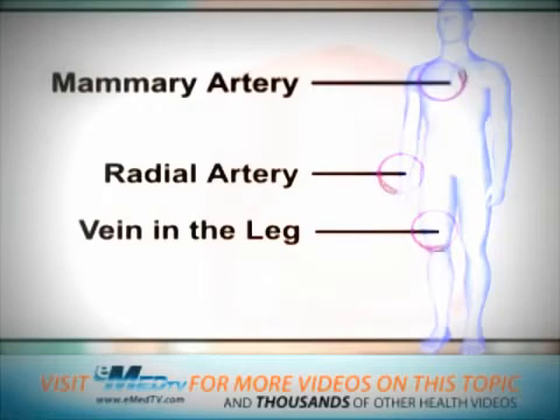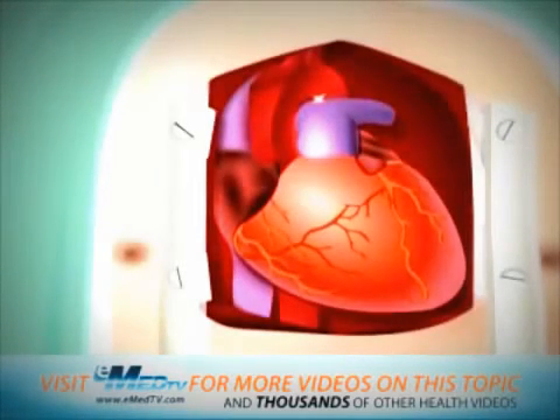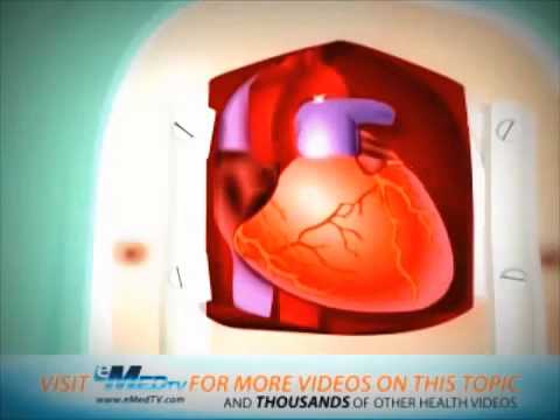Once this is done, the bypass procedure can continue. At this point, the heart will need to be cooled to keep it still. During this time, the heart will be connected to the heart-lung bypass machine.